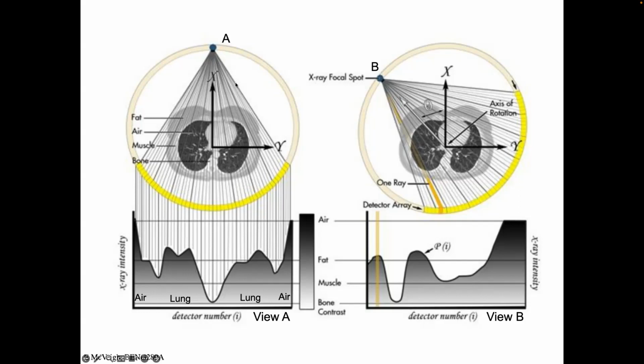Out here, this very edge of the detection is essentially how many photons were released from my X-ray tube, because they haven't hit anything other than air. And air has negligible attenuation, right? So if I have a clear shot through air, then I see a lot of X-rays counted in my detector, okay? So there's my shadow, right? And it's at this angle.